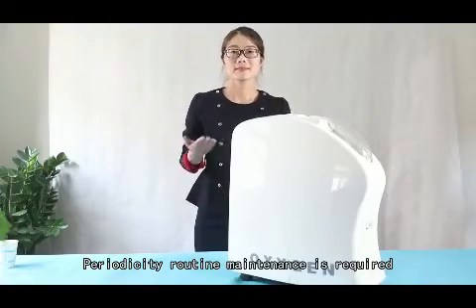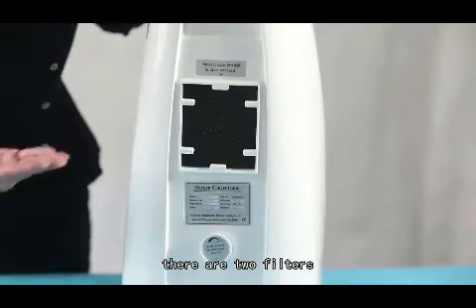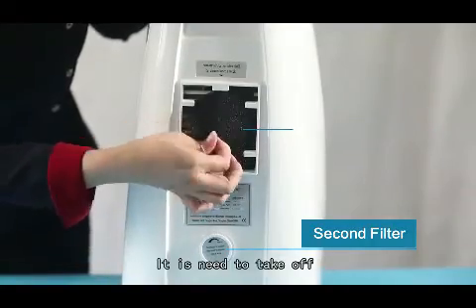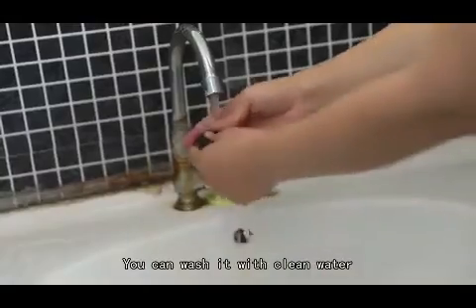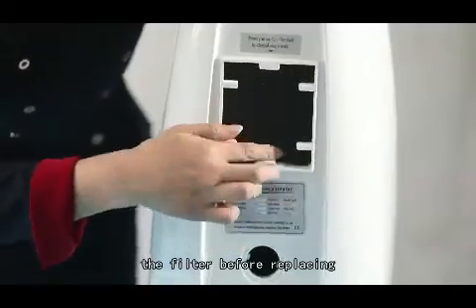Periodic routine maintenance is required. On the back of the unit, there are two filters, the first and second filter. It is needed to take off and clean both filters once a week. You can wash them with clean water. Be sure to thoroughly dry the filter before replacing it.